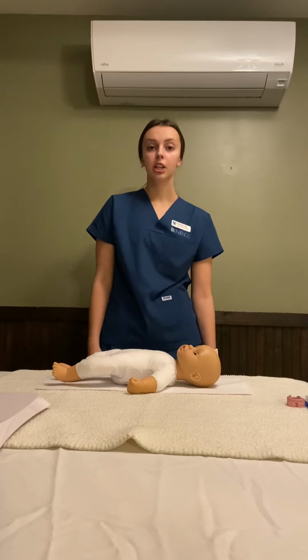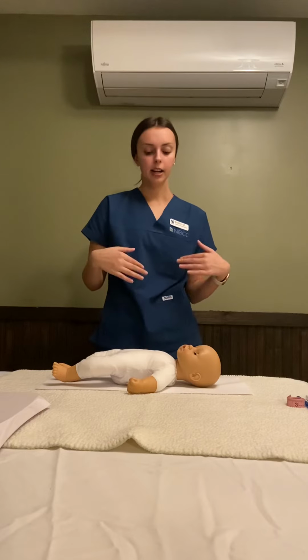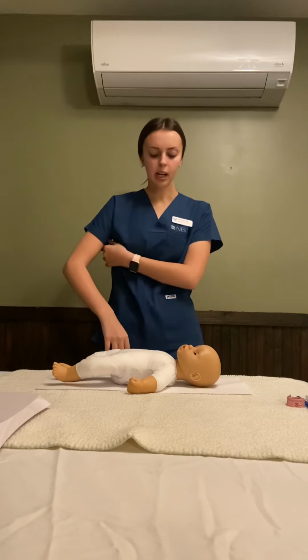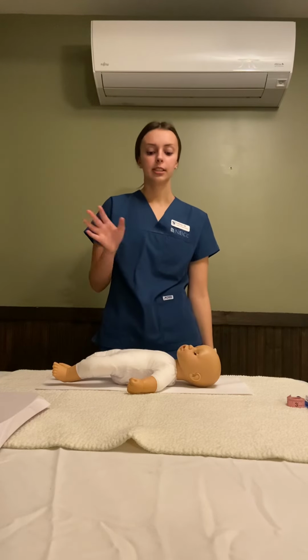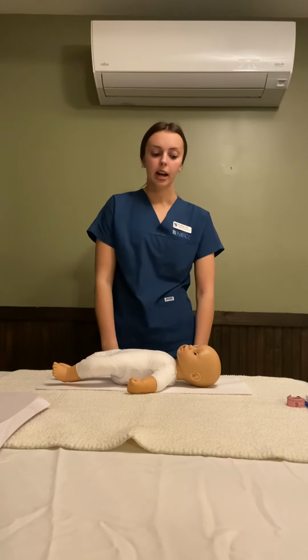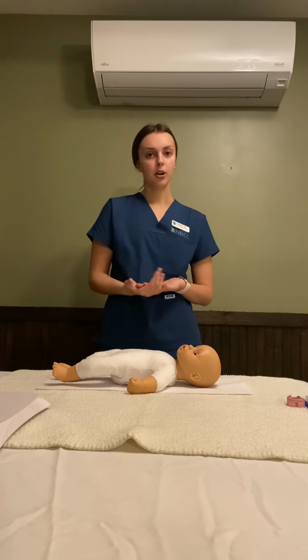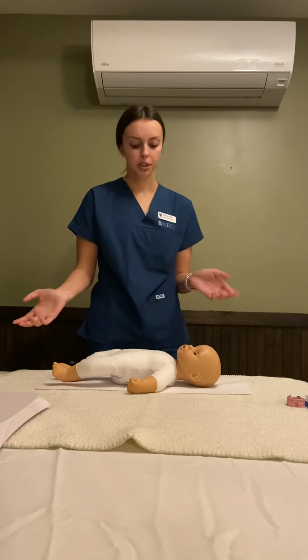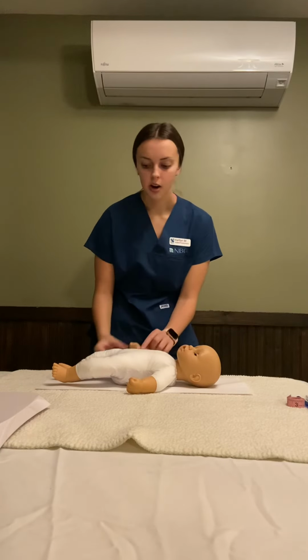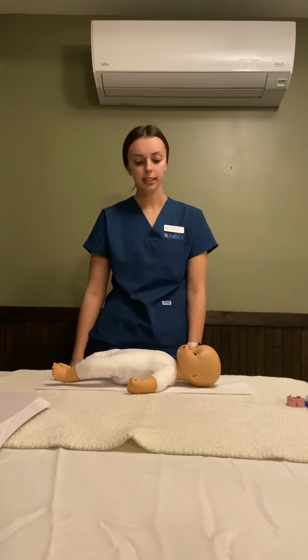And then after that, you would take the blood pressure of the upper and lower extremities on the same side, and then after you take it, you would note any variation between the two. And normal range is 65/30 to 95/60. And then after that, I'm going to take the O2 saturation. And I don't have an O2 monitor, but typically, depending on which one you were doing, you would just clip it onto the hand or onto the foot. And the normal range is 92% within normal limits.